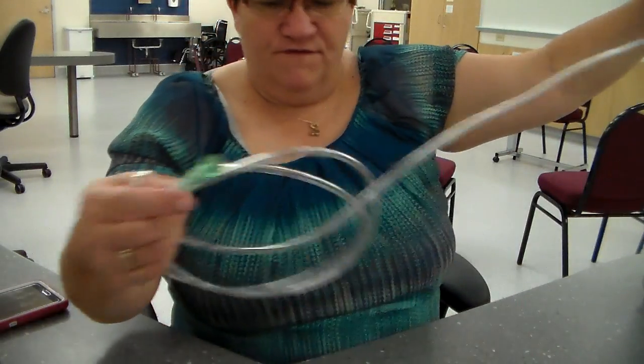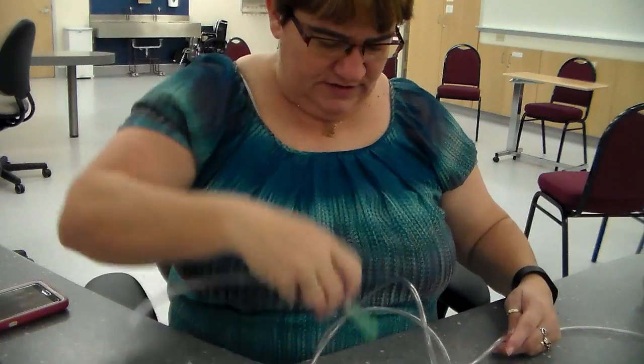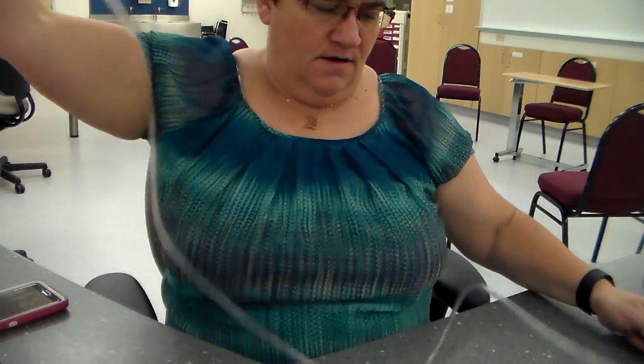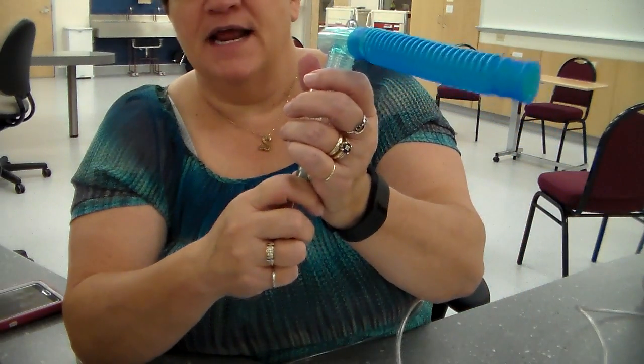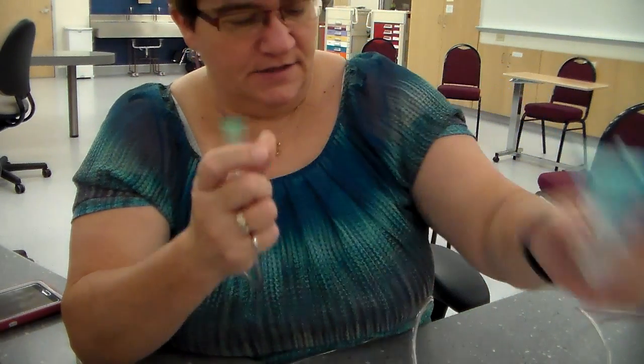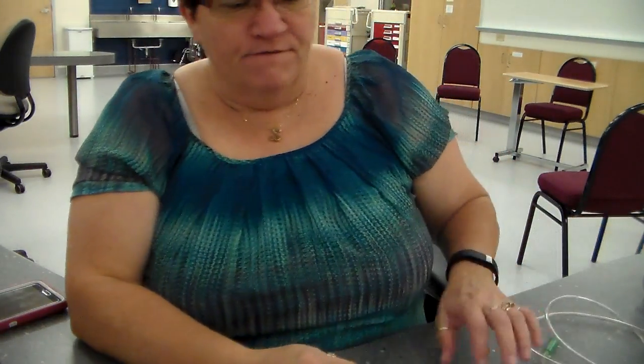So facilities would use the wall-mounted air mechanisms, and again it would be connected to the bottom of the nebulizer. All right, so the first thing you're going to do with any medication administration is check your medication order. You're going to make sure that you have a nebulizer medication that is due for your patient at this time.